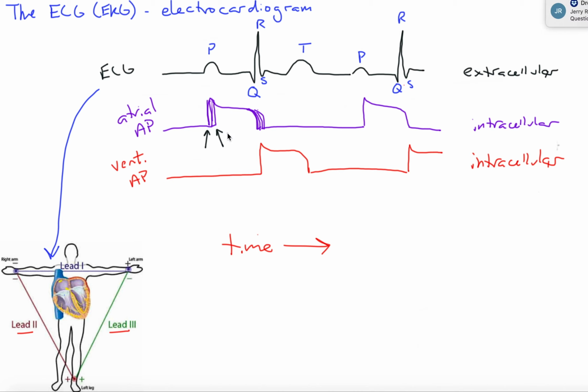And so in between that region, where I have some depolarized, the early ones here, and some not over here, we have a dipole. If we have a dipole, we have a voltage. If we have a voltage and we have our electrodes on our body, we are going to get a wave. Sorry, that line's not quite straight there. But so atrial depolarization corresponds with the P wave.